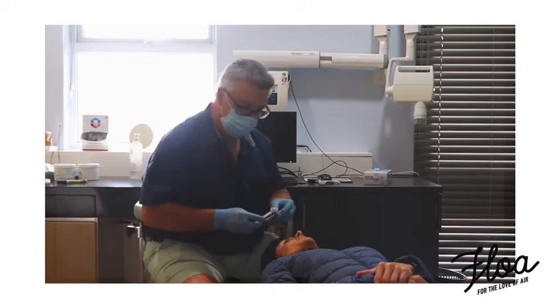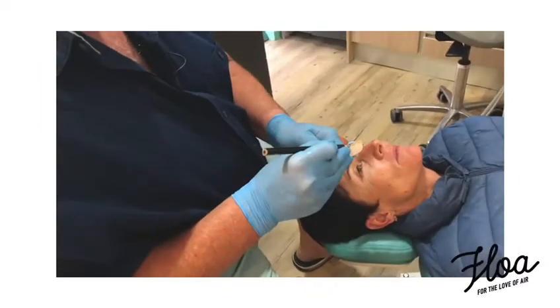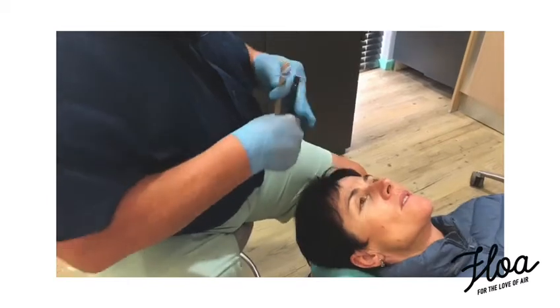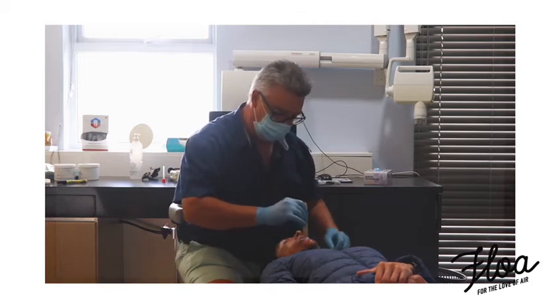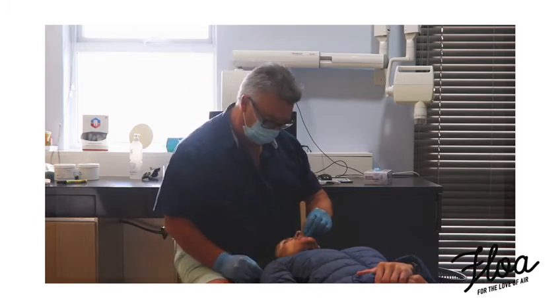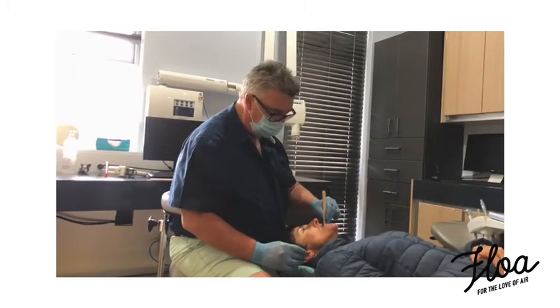We simply take a second little stick, put it on top of the first one, take your pencil, and remember to mark your position. We're going to go through exactly the same process again. Bite closed for me, lower your jaw just a little bit forward so we're back onto our mark. Give me a nice snore again — that sounds good. A little bit further forward, another nice snore. And a little bit further forward — it's actually slowly getting worse, so go back a bit.